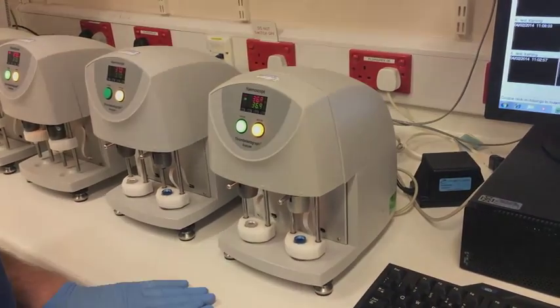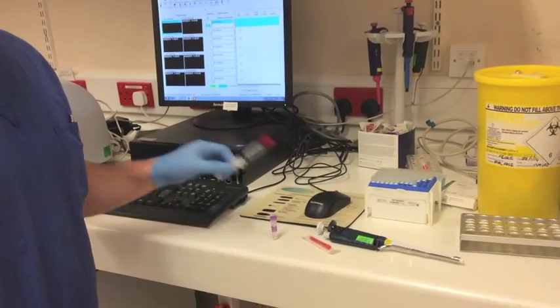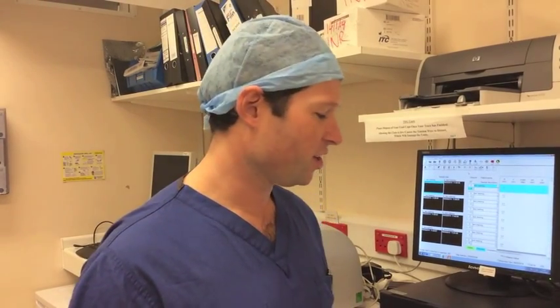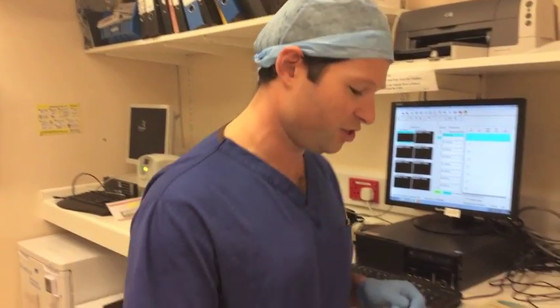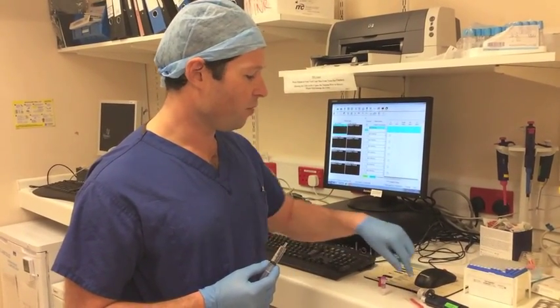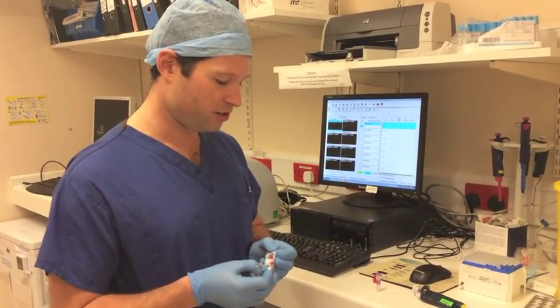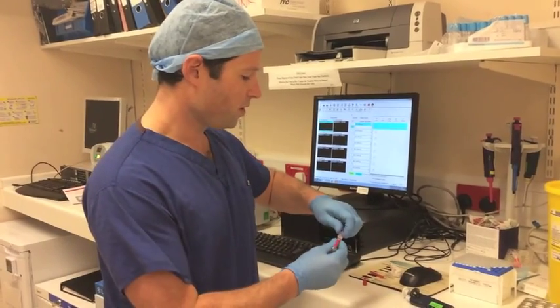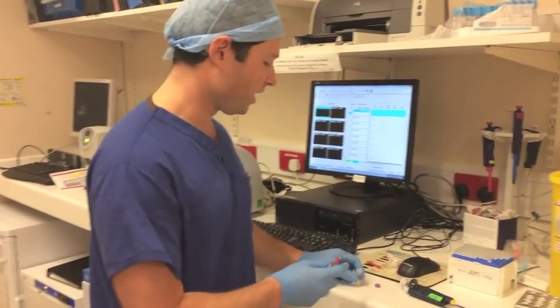We're now going to pipette the blood into the TEG machine to start running the traces and give us our thromboelastography trace. It's important to remember that this is a time-critical procedure because our blood sample from our patient will be clotting whilst we're preparing our TEG trace, so it needs to be done within about four minutes maximum — you need to be moving with some speed. What we need to do is transfer one ml of blood into our kaolin bottle, which we'll then pipette into the cups. We'll use a needle to do that, remembering always to wear gloves when handling any bodily fluids. We fill to the one ml line, which is clearly marked on the side of the kaolin bottle.